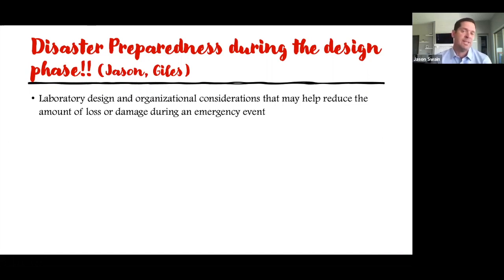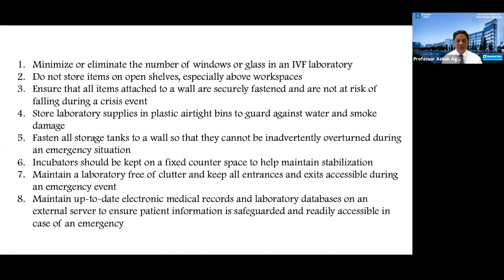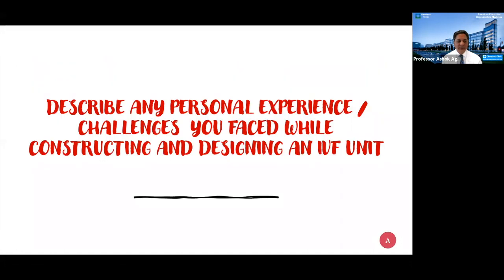In terms of laboratory design and actual construction, I think we've covered most of those things in terms of making sure you've got the right safety measures in place. Whether it's earthquake, if you're at an earthquake-prone location, making sure you have restraints for incubators and other pieces of equipment, generator backup, power backup, all the redundancies that we've discussed. Okay, Giles, you want to add to that? Giles can comment about the disaster preparedness.